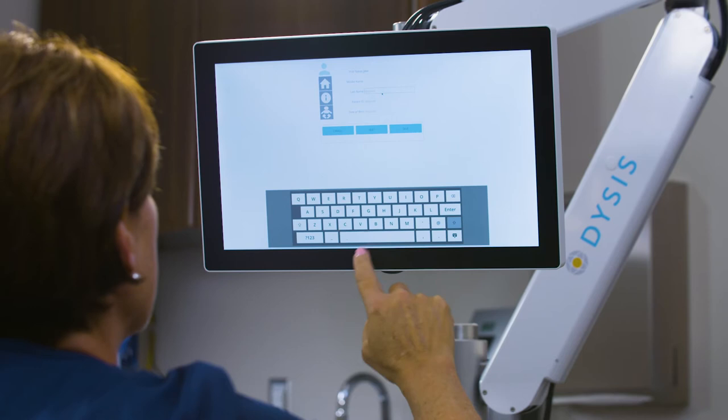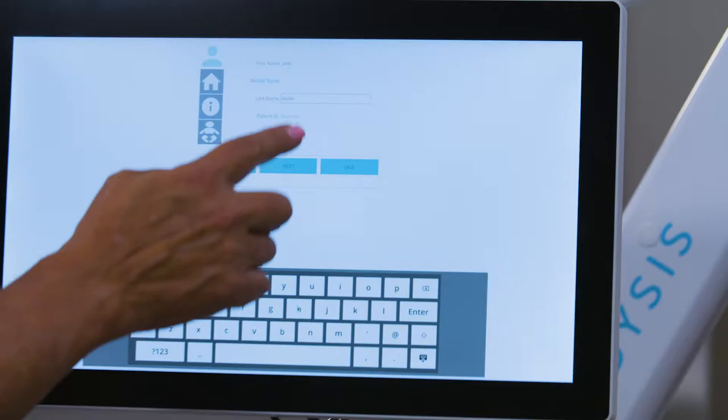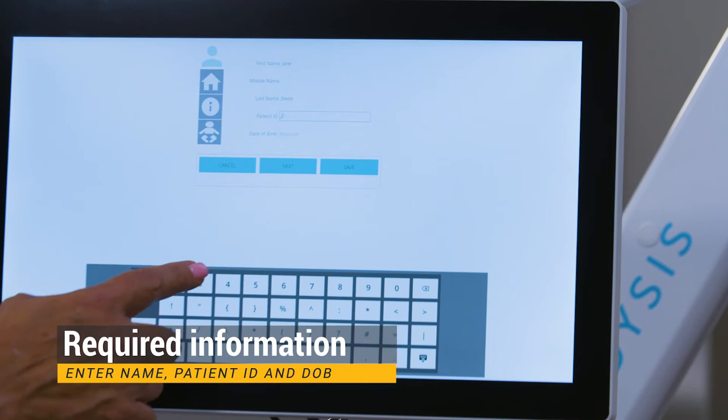Enter the first name, last name, patient ID number, and date of birth. To enter the date of birth, select the month, day, and year and press OK. Additional information can be added by selecting the corresponding icon.